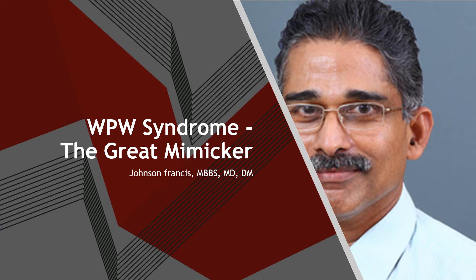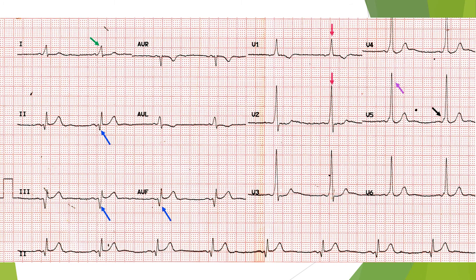WPW syndrome is a great mimicker on the electrocardiogram. It can mimic various conditions which we will come to shortly. This ECG shows WPW syndrome. In V5 you can see a black arrow which marks the delta wave as well as short PR interval, which are characteristic of WPW syndrome.